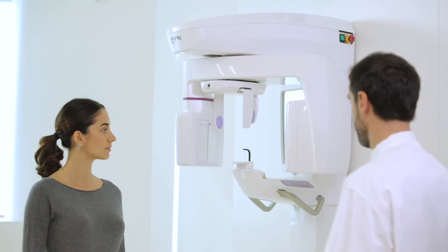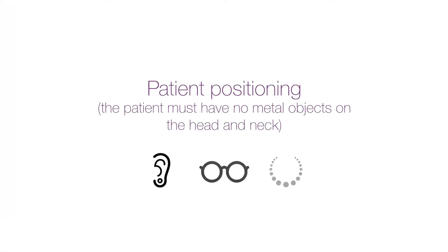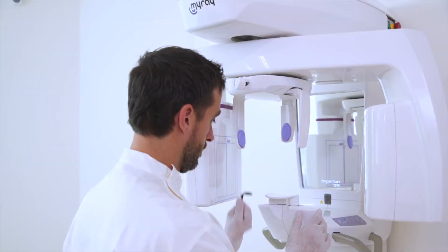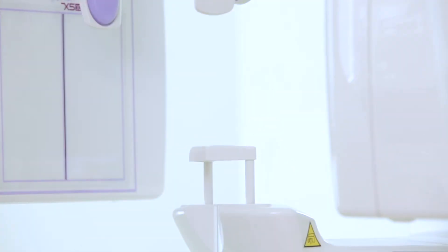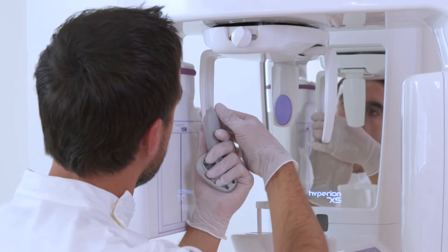For a successful X-ray scan, it is important to start by correctly positioning the patient. In the case of a TMJ scan, it is necessary to remove the bite and chin rest and replace them with the subnasal support.